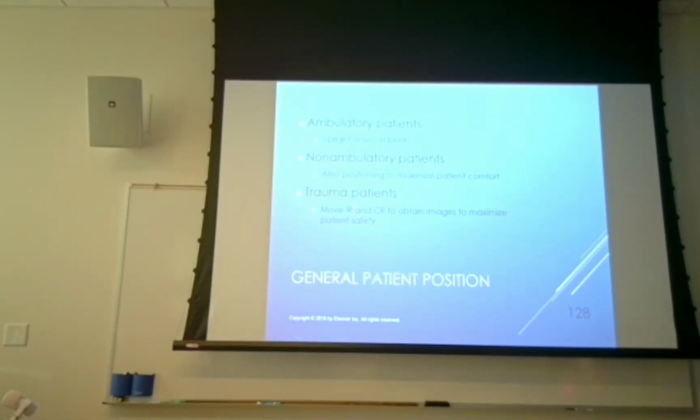The trend right now is for patients who are truly in a trauma to go straight to CT, right? So we're not doing a whole lot of trauma procedures in the trauma room diagnostic x-ray. We can, but CT just shows us much more stuff, right? So we tend to send the patients directly to CT.